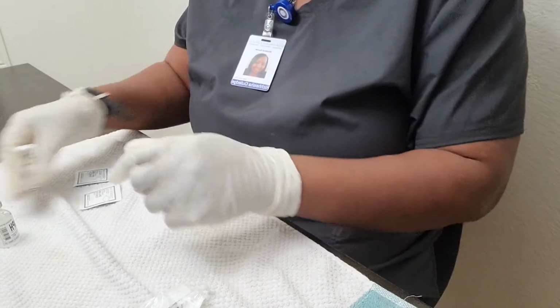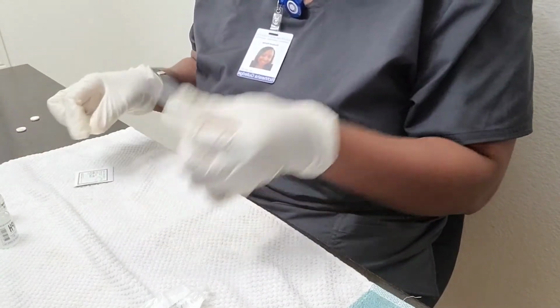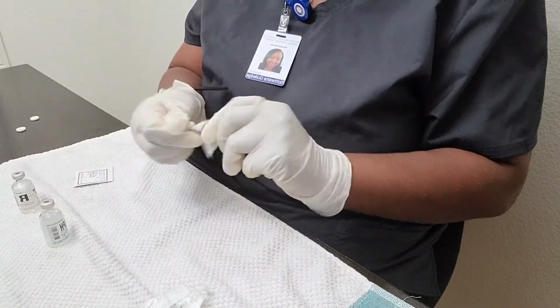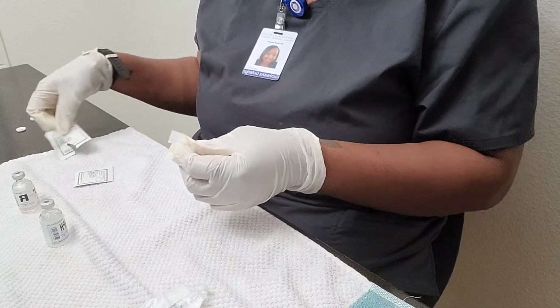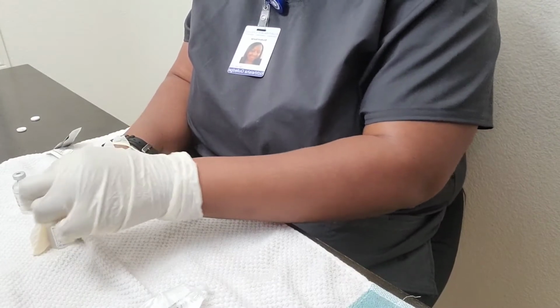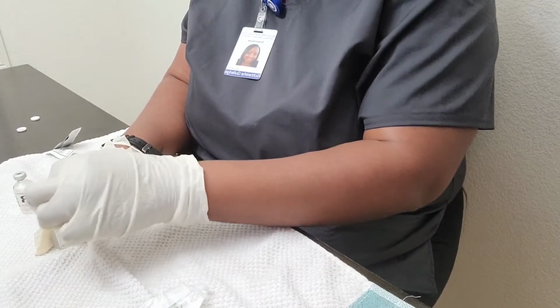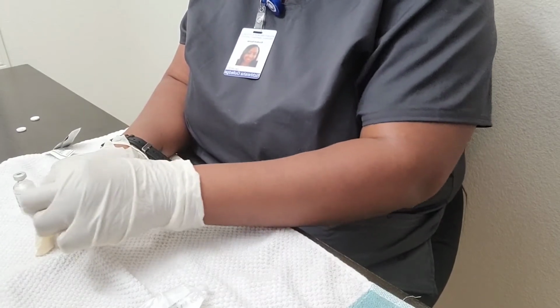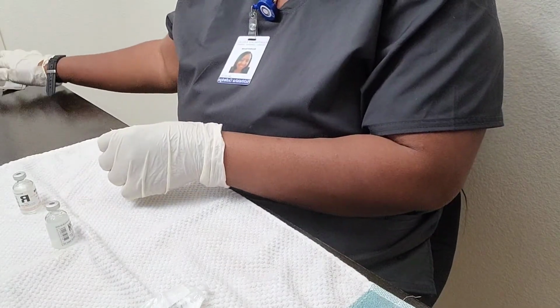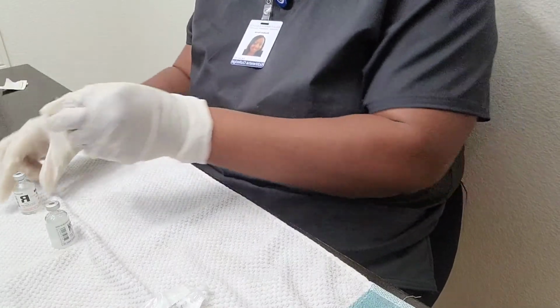Okay, so now I am going to take an alcohol pad and I'm going to clean the top of each vial. This will go to the trash. And then I will do another one, separate, for the other one.